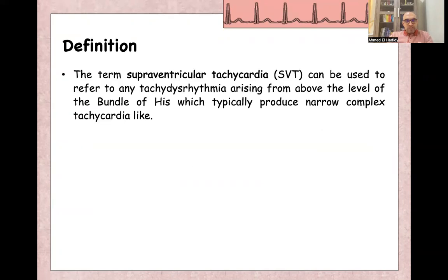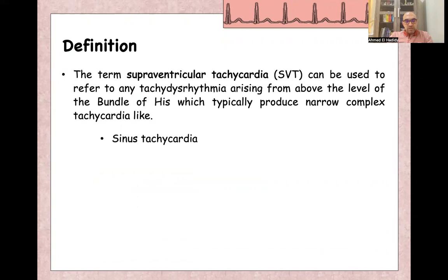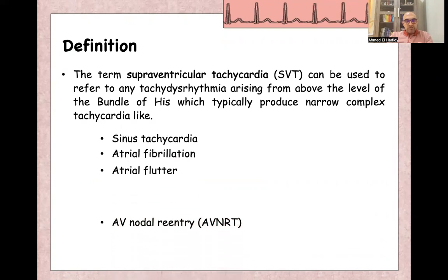For definition, the term supraventricular tachycardia can be used to refer to any tachyarrhythmia above the level of the bundle of His, and usually it produces narrow complex tachycardia, like sinus tachycardia and atrial fibrillation.